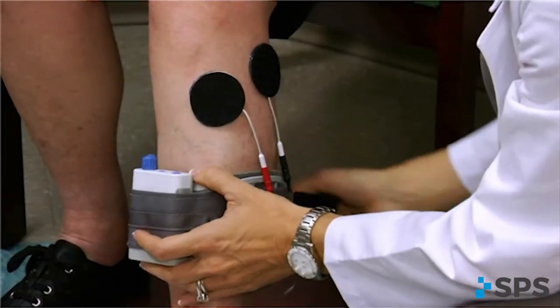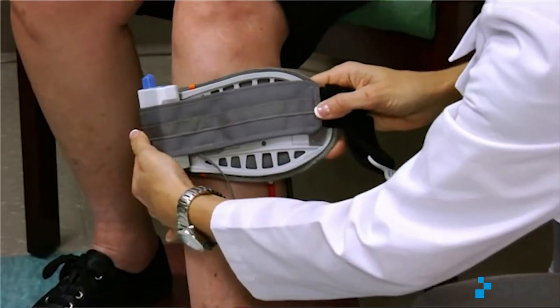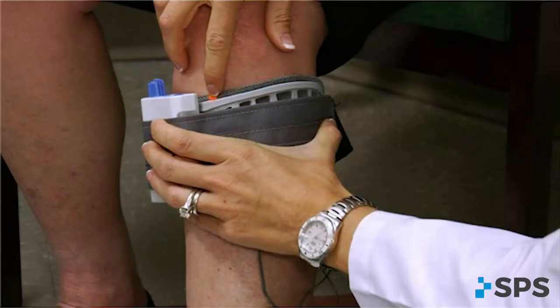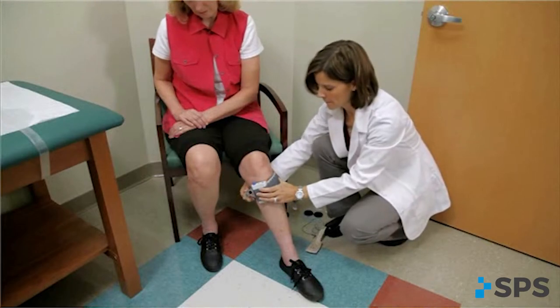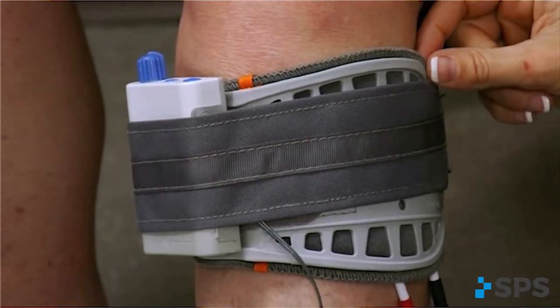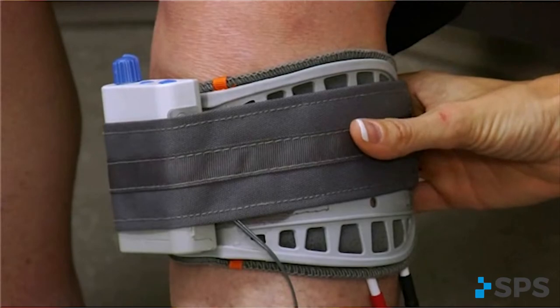Once you have identified the optimal electrode placement, apply the cuff over the electrodes. Be careful not to touch the cuff to the electrodes inadvertently, as the velcro on the electrodes will attach to the cuff and may pull the electrodes away from the skin. Align the orange tibial crest marker on the cuff with the tibial crest. Slowly wrap the cuff laterally to capture the electrodes. While holding the cuff securely in place with one hand, fasten the buckle closure. There should be no gapping between the cuff and the leg. The cuff should fit snugly and comfortably to promote complete contact between the electrodes and the skin. If necessary, use a pinch pad to prevent discomfort where the edges of the cuff meet posteriorly.